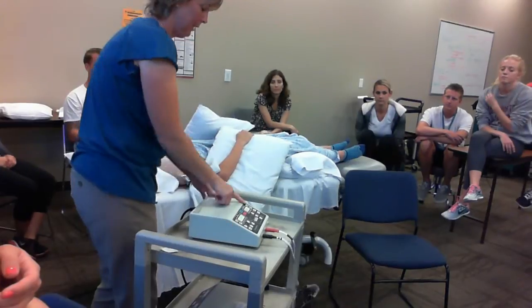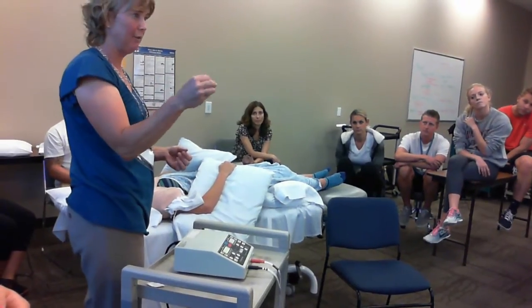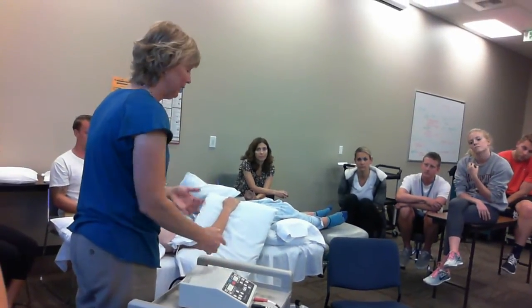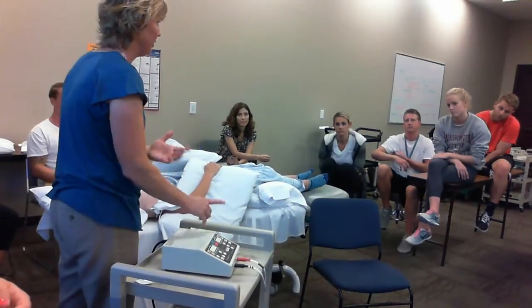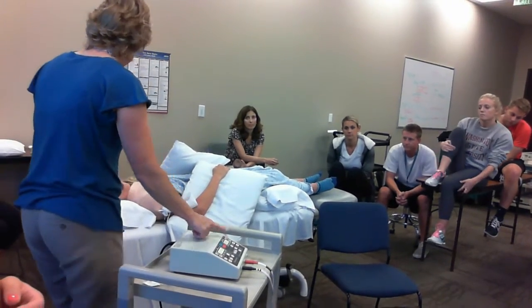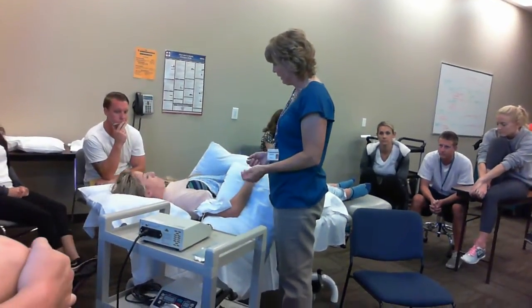All right, so I'm going to go ahead and turn it up. Now with this machine, it goes up in 0.5s, but it doesn't show you that on the screen. So when I hit it once, it might not move, but then if I hit it again, it'll jump up to 3, and then I hit it again, and now it's 3.5, but it doesn't show it. So if you hit it once and nothing moves, just try to hit it one more time, and you'll see it move. And I want to look at my patient. I really want a treatment triangle. I would like to be able to see my machine. I would like to see my patient's response.